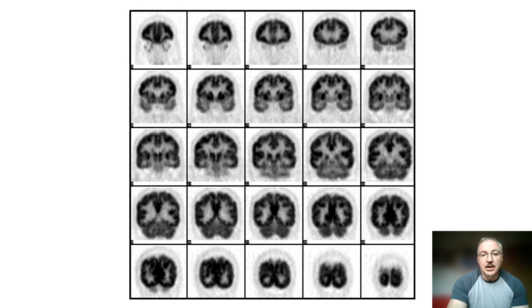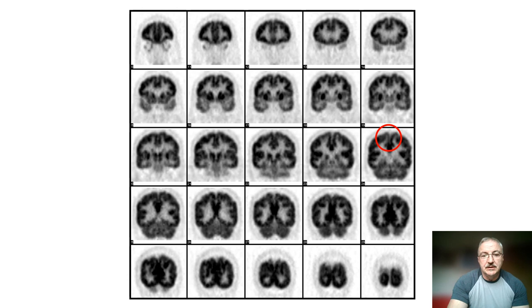In the coronal imaging, this gives us an overview and we can see the general intensity — most intense in the occipital and then grading forward into the frontal. A good region to check, especially on the rainbow scale, is the intensity within the precuneus, which we compare with the level of intensity just anterior within the medial posterior frontal lobes.